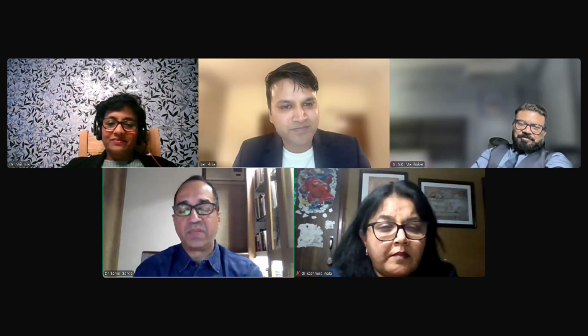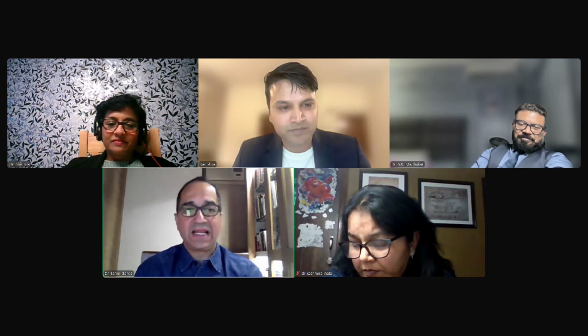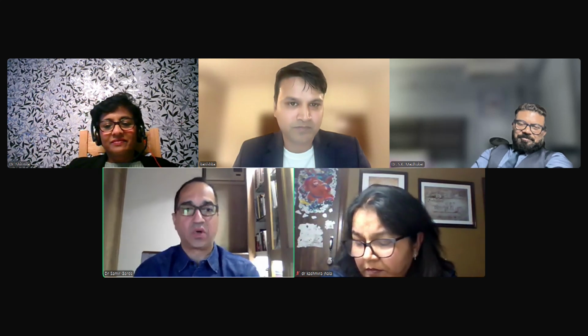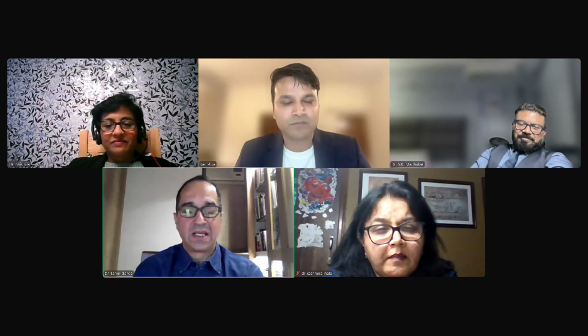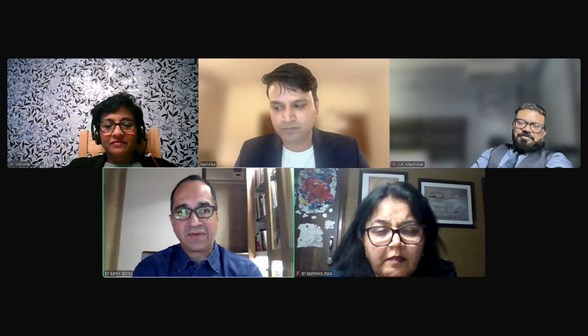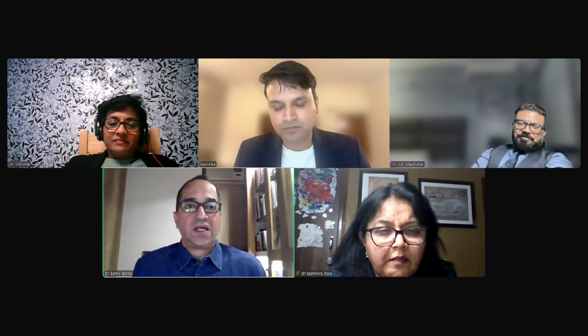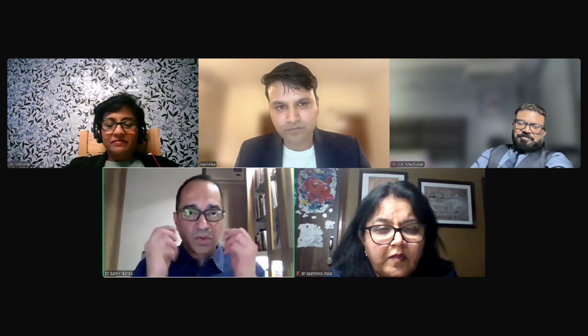Right. So bridge, I'm thinking he's asking about lung transplant when you're talking about bridging. And when you're talking about bridging in restrictive lung disease, I take it as end-stage fibrotic lung disease going in for a lung transplant and requiring this. So yes, it's all tailor-made. To be very frank, you can use HFNO depending on whether the patient is tolerating NIV or not. High flow oxygen itself isn't really the solution. It's like you are putting coins in a torn pocket. So you'll have to give augmented oxygen through HFNC or NIV.